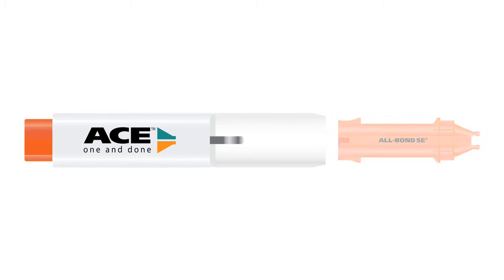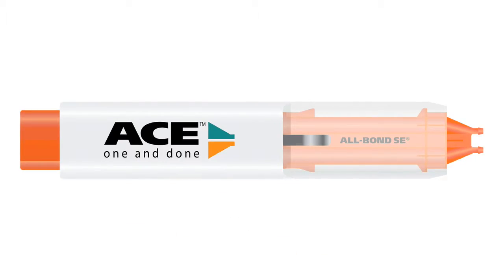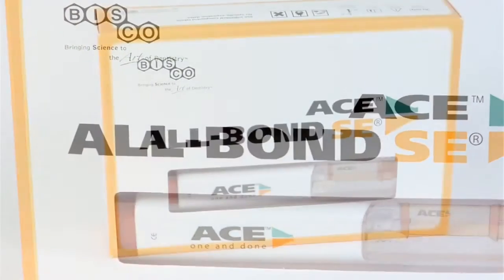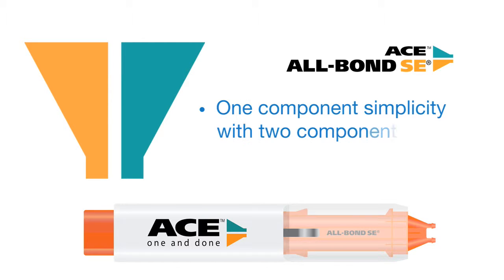Allbond SE comes in a convenient cartridge delivery that fits into the Ace Dispenser. The Ace Dispenser takes the guesswork and time out of every bonding procedure by accurately dispensing the correct proportion of material, offering the stability of a two-component self-etch adhesive with the ease and convenience of a one-bottle system for predictable results every time.